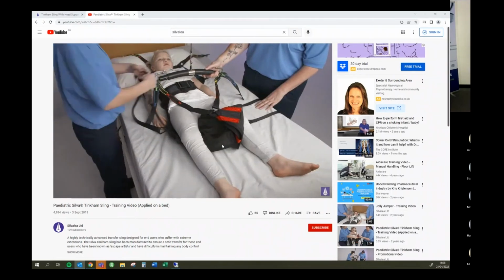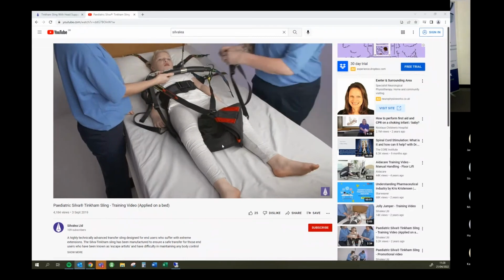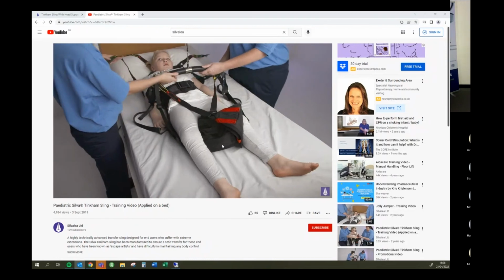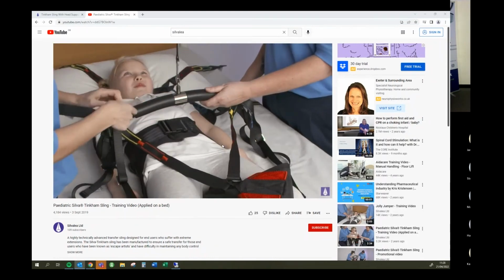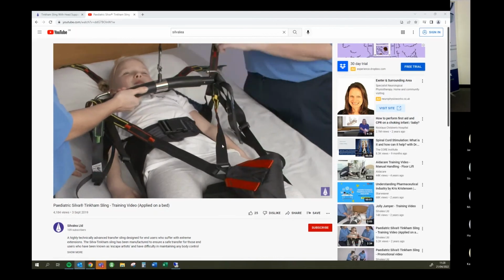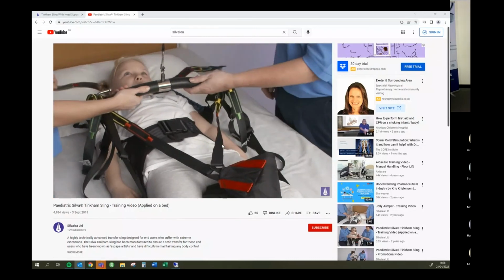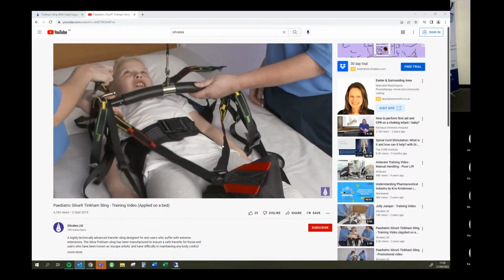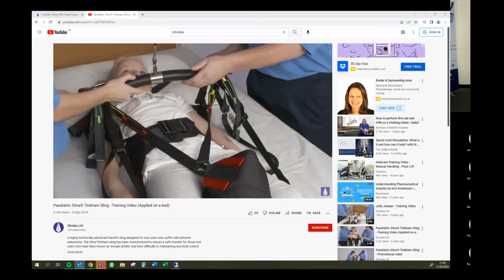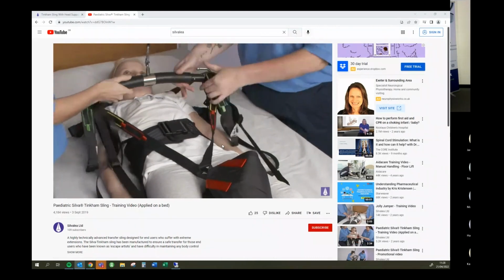Then there's two hip tapes. The hip tapes are on slider adjusters, and they would then need to be adjusted during your initial risk assessment and positioning, but they hook on. And then you've got the shoulder tape, and finally a head support tape. So lots going on there, but we have solved a lot of very challenging situations in the past all over the world using this particular style.